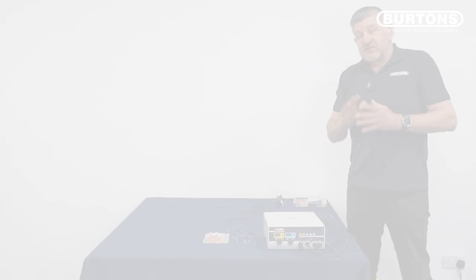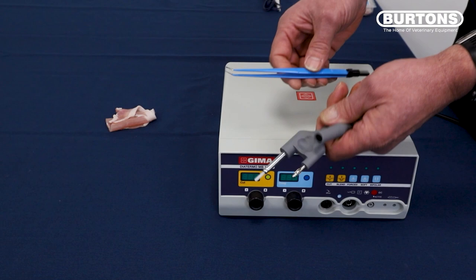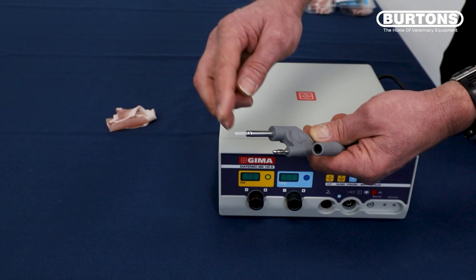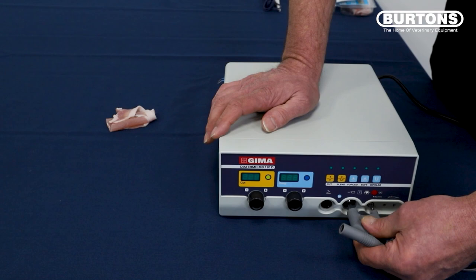So now we've looked at the monopolar setup. I'm going to reset the machine for bipolar and have a look at how we use the bipolar option. To use the machine in bipolar mode, there are a couple of accessories you need to order: one is the reusable autoclaveable bipolar cable, and bipolar forceps. The cable has a plastic connector on the end — please don't try to remove this, it's meant to be there, because it's used to switch the machine internally from monopolar mode to bipolar mode. This plugs into where you would normally put the grounding plate in. And the forceps — there's no right or wrong way to put these in, either way around will do, and they just plug into the end of the cable.